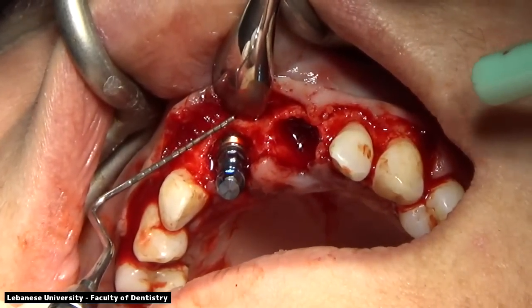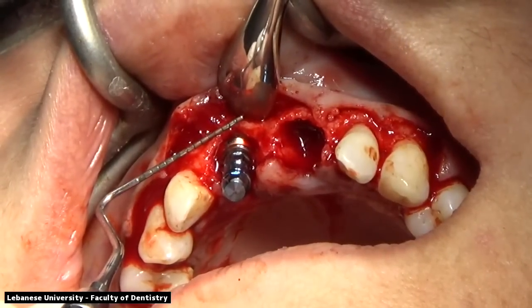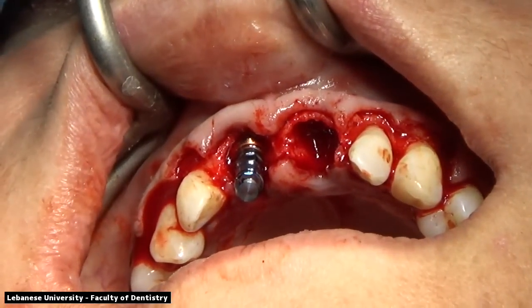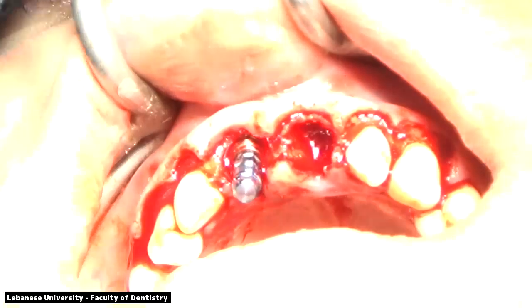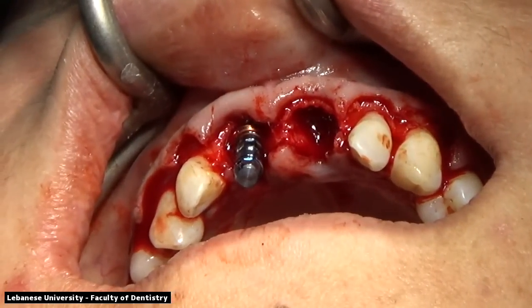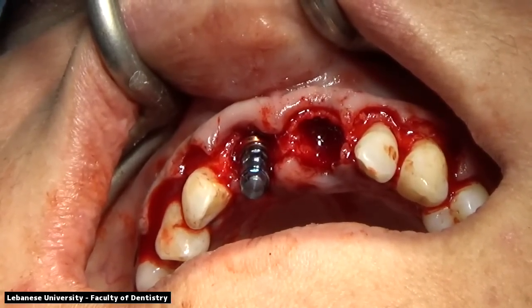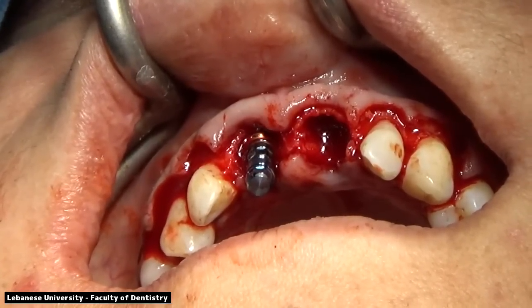So we're comparing the level of the implant to the cementoenamel junction of the neighboring tooth, and we are 2 millimeters away from the cementoenamel junction of the neighboring tooth. This is just a confirmation that our implant level is at the buccal plate of bone, crestal aspect of it, and it is 2 millimeters below the cementoenamel junction of the neighboring tooth. This will help us have a scalloped margin, a proper biologic width, and a proper soft tissue profile and emergence around this implant.